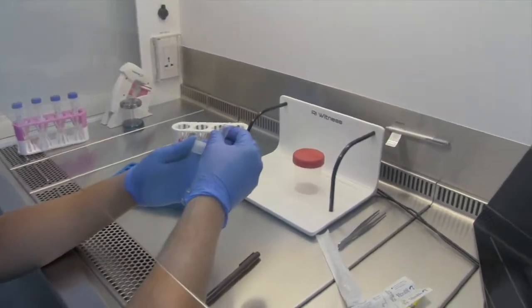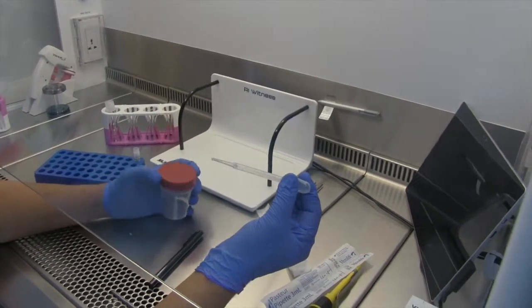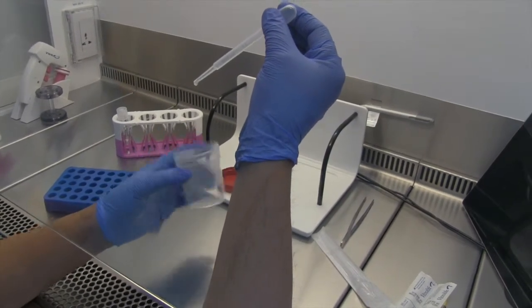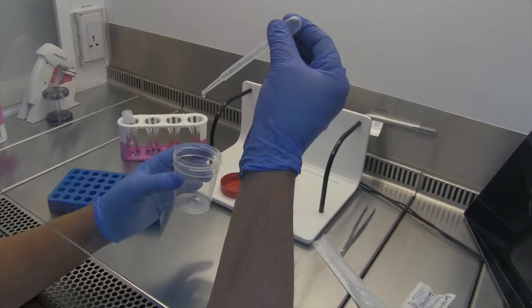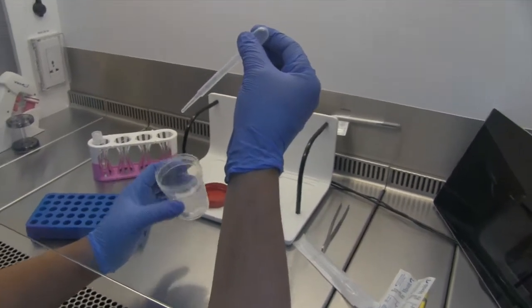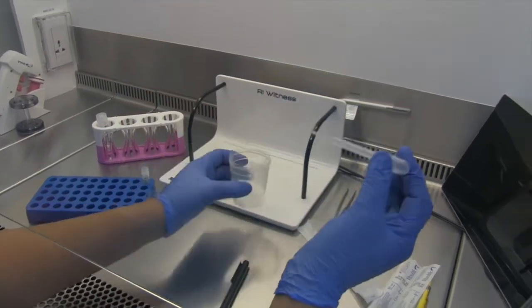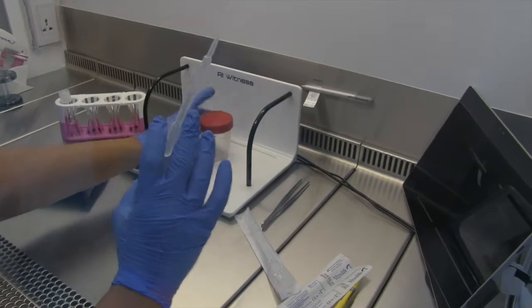We will take one third of the cryomedia — one mil — and add it to our three mils of semen in a very aseptic manner. The cryoprotectant has to be added in a very drop-wise manner with continuous agitation or shaking, so that there is no osmotic shock to the sperm. Very gradually, drop by drop, add the cryo to the semen and keep shaking until you have added the full lot of cryoprotectant. Then let the sperm mix with the cryo for at least 10 minutes before you load the vial.